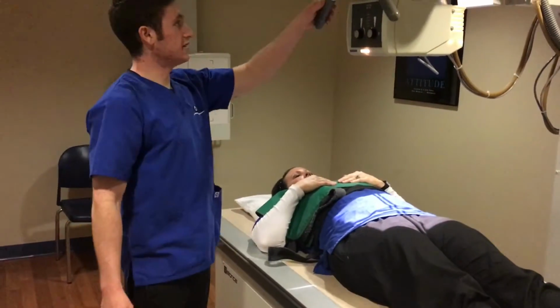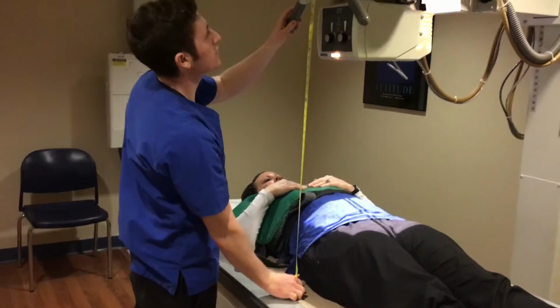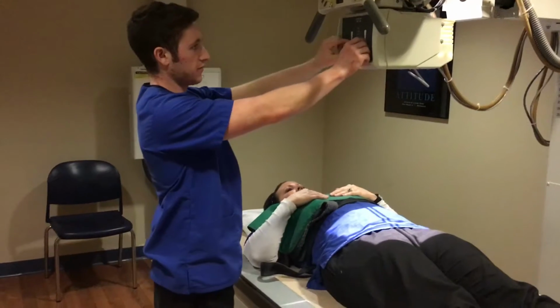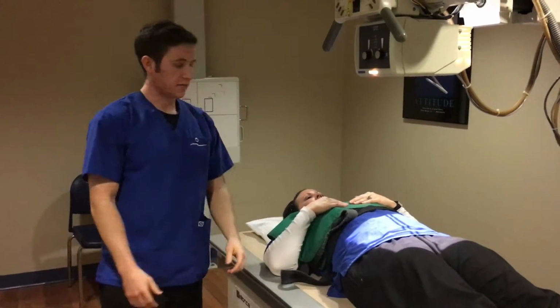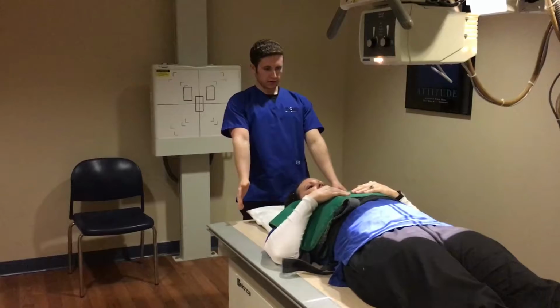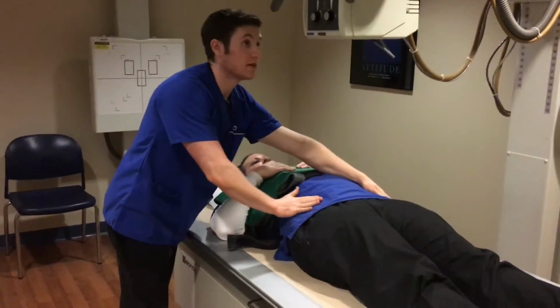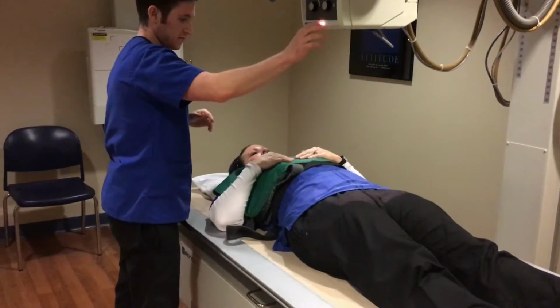I'm in transverse detent. I've got a 40-inch SID again. We'll just double check that here. 38 to the tabletop. I've collimated open to 14x17. For positioning, I just have my patient flat on her back. I'm going to come to the table, make sure she's not tilted at all. I'm going to palpate both ASIS to make sure they're equidistant from the tabletop, which they are.